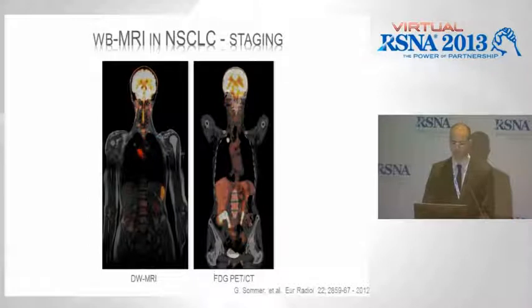Nice image showing a very small lung cancer here, comparing the diffusion-weighted imaging fused with the morphologic sequence and the PET findings there.